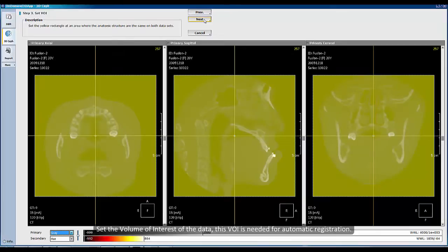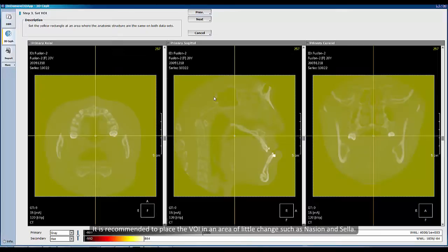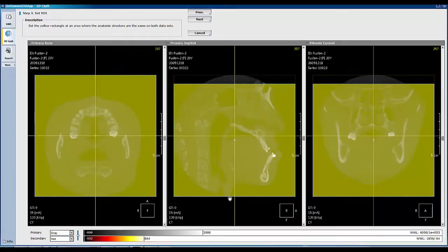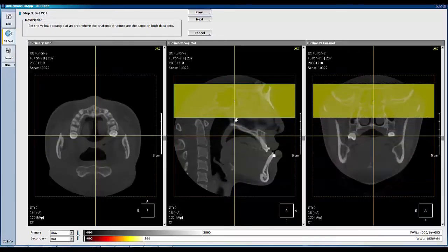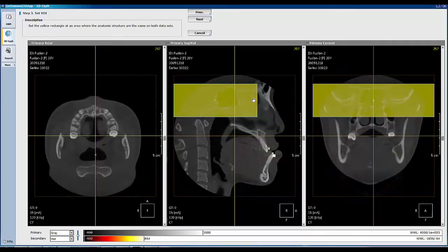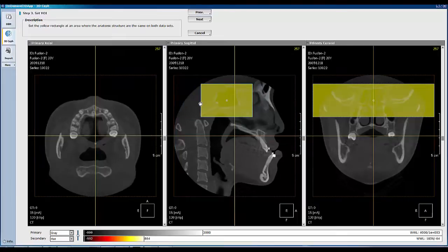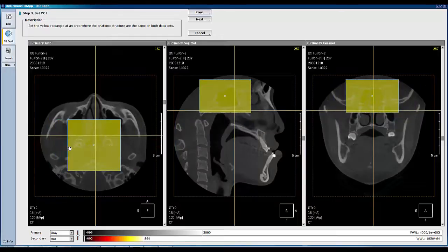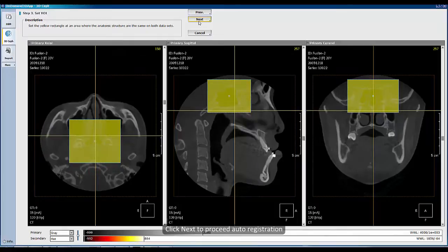Set the volume of interest of the data. Since VOI is needed for automatic registration, adjust the size of the yellow rectangular using axial, sagittal, and coronal pins. It is recommended to place the VOI in an area of little change, such as the nasion and sella. Auto-registration will take more time if the VOI is set over a large area, and accuracy is affected if the area is set too small.